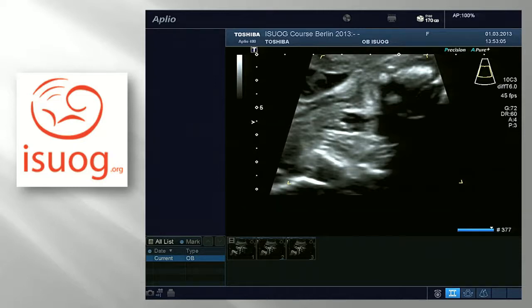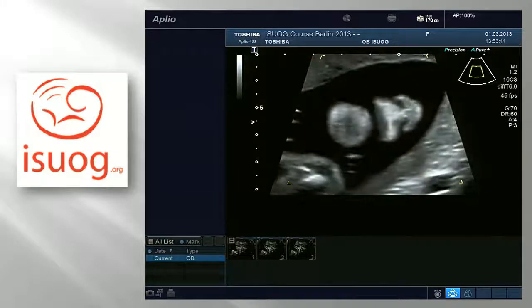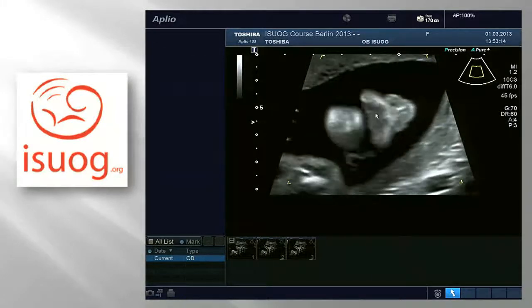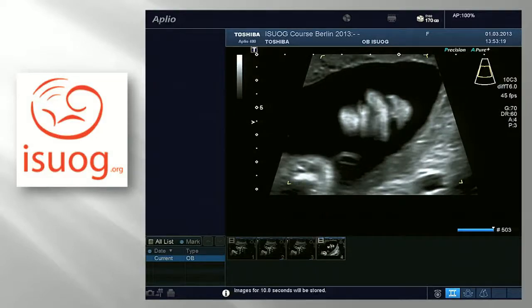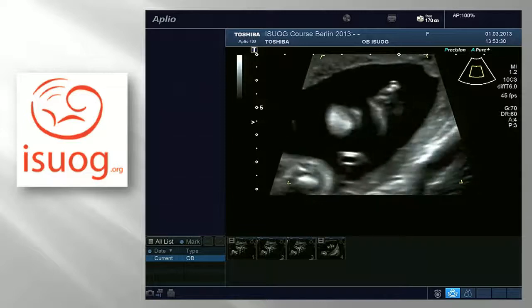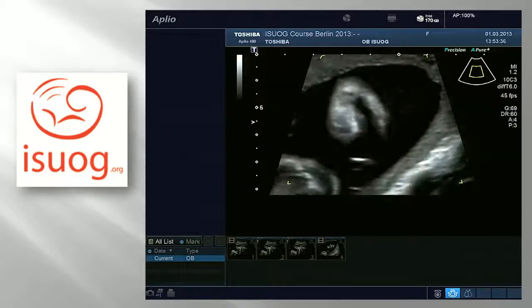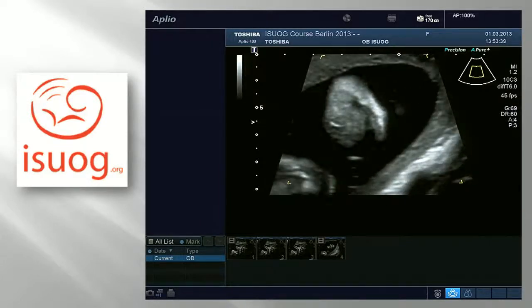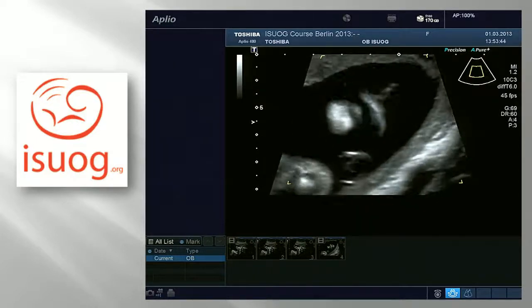So if the end of the palate is closed, you go to the beginning of the system, and you see here the lips. The lips are closed, so if the lips are closed and the uvula is okay, so the space between is okay too. So you can be sure there's no cleft. If you have this section, it makes sense to turn into a little bit oblique view to check the lateral ends of the mouth. It's a very rare condition, but sometimes you can find lateral clefts.